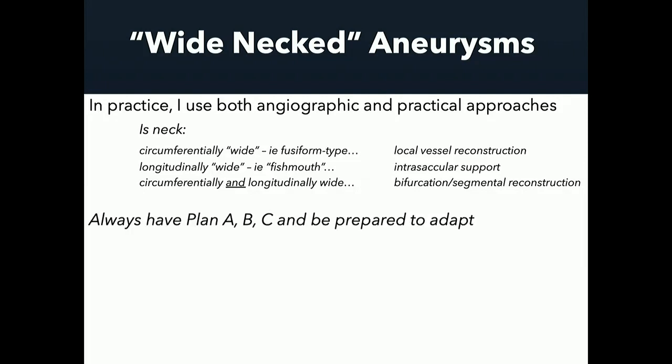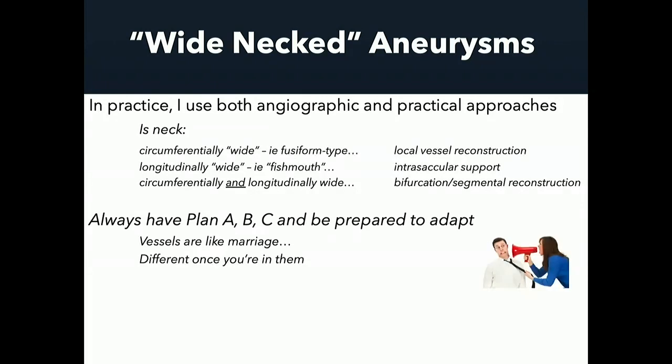Now, when I'm treating any aneurysm, but particularly wide-necked aneurysms, I think it's important that we have a plan A, a plan B, and a plan C, and be prepared to adapt your strategy to the case at hand. Vessels, to me, are a little bit like marriage. They're a little bit different once you're in them. So you need to be prepared to change and adapt once you start treating your aneurysm.